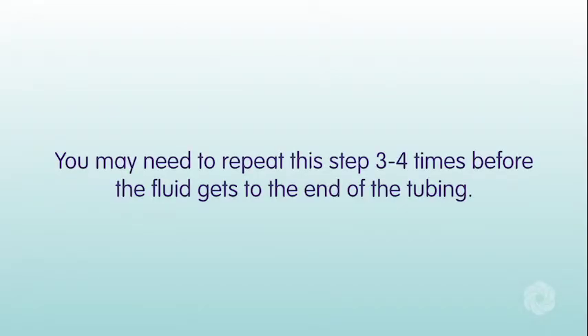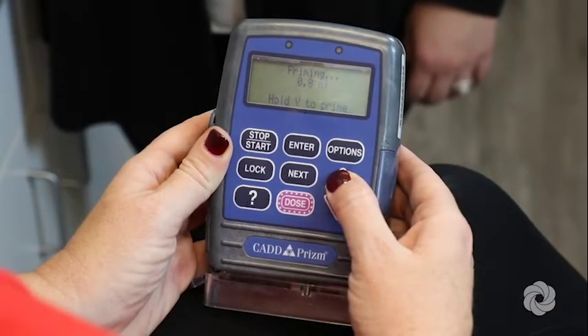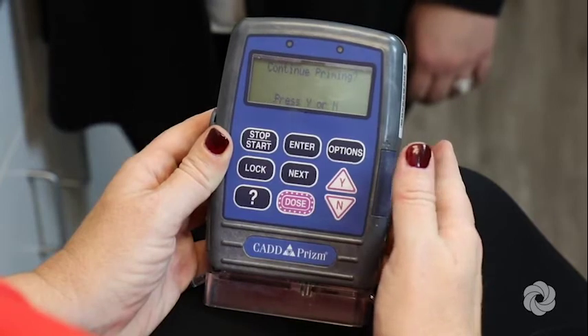You may need to repeat this step three to four times before the fluid gets to the end of the tubing. Lastly, when priming is complete and 'continue priming' appears on the screen, press the N key.